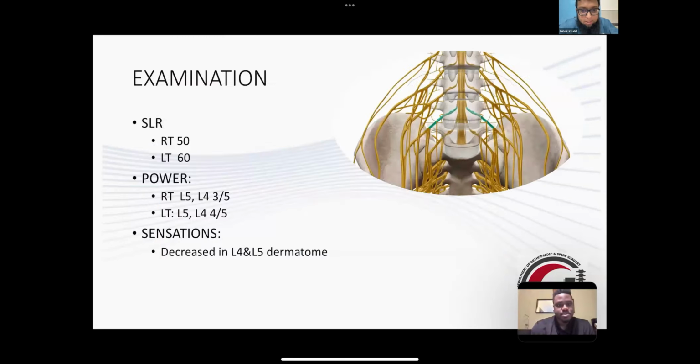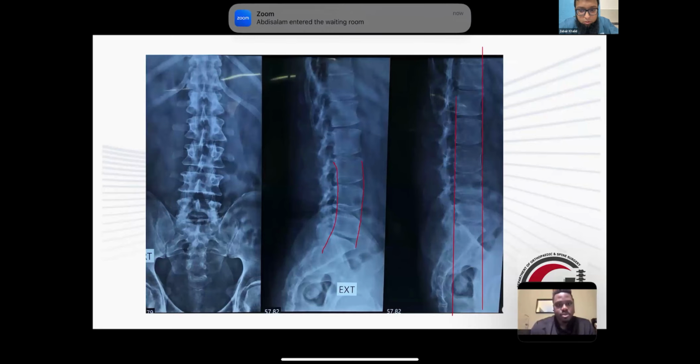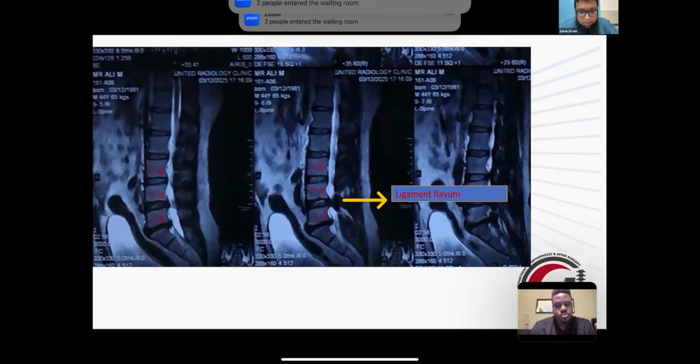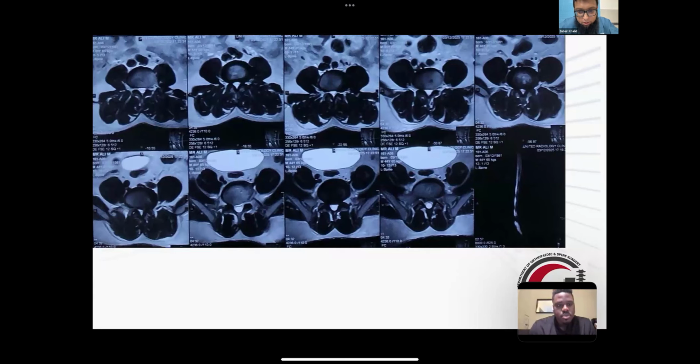One of the main reasons is that this patient has no instability on the dynamic X-rays, and the patient has a history of neurogenic claudication with more prominent symptoms on the right side. If we see the MRI, there is hypertrophic ligamentum flavum pressing at the L4-5 level, and there is more stenosis at the paracentral region and the right L5 foramen. As the patient has no instability, I will not go for any fusion technique.